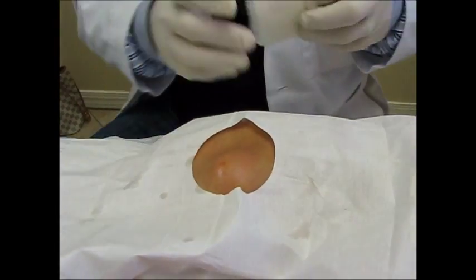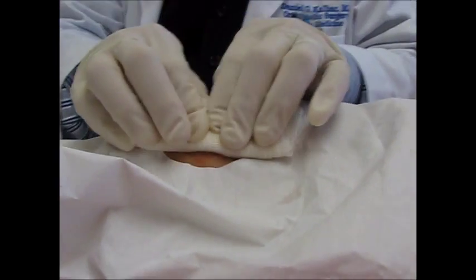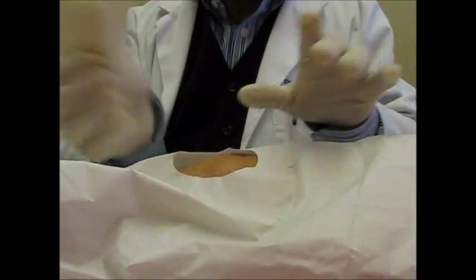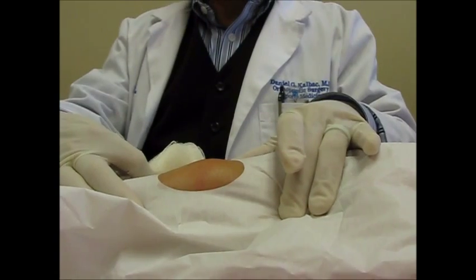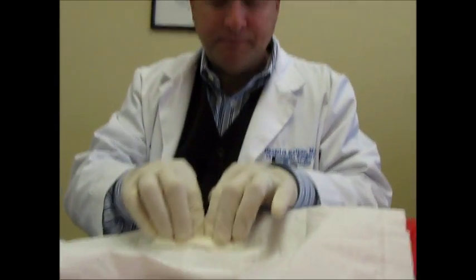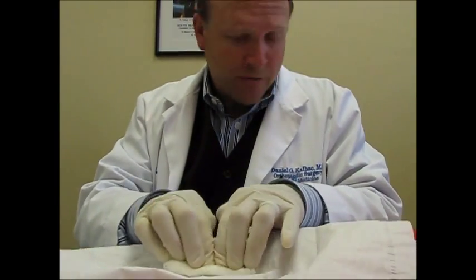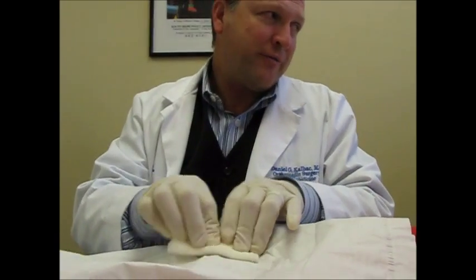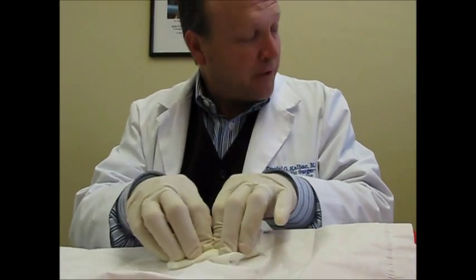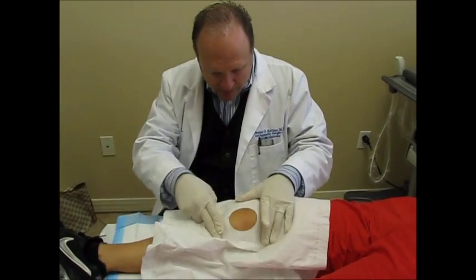Now I take this out — see how there's a wheal of plasma? Look how big it is. I'm going to massage it in to really get it into where it needs to heal the tissue. It's already going down. I just massage it into the partially torn ligament. She's not feeling any pain even though I'm pushing hard. Some docs don't advocate using lidocaine, but I think that's kind of barbaric — I definitely numb it up first, otherwise it would be a lot more painful.